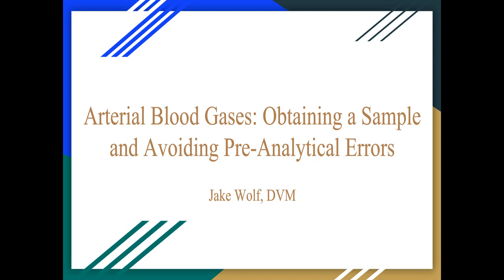When thinking about the term pre-analytical errors, a number of studies have explained this quite nicely in describing a brain-to-brain loop concept, where an initial test is ordered, first brain, and then it is evaluated later on, the second brain concept. And in between, we have the pre-analytical portion, which marks the time from the ordering of the test to inserting the sample into a machine. The analytical period, which involves the machine's analysis of the sample, and then the post-analytical period, or the physician's interpretation of the results produced by the machine.